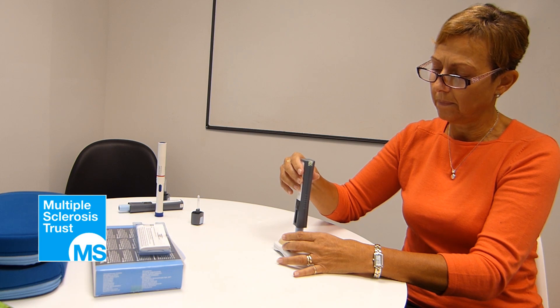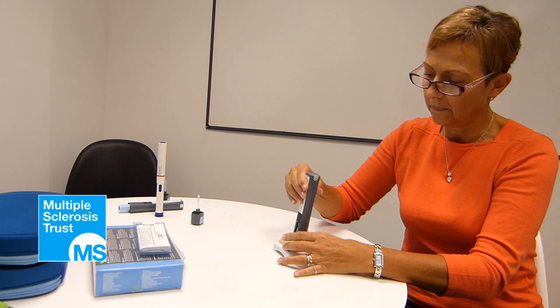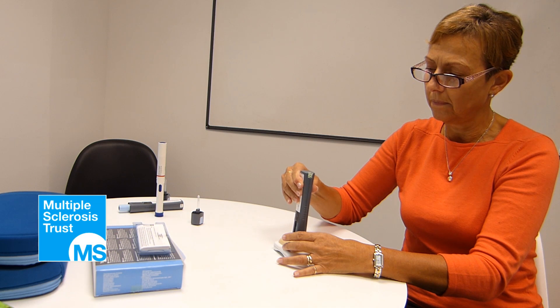When you're ready to inject, firmly press the pen on the injection site in one fluid movement. This will activate the pen and ensure the injection takes place. Hold it steady.